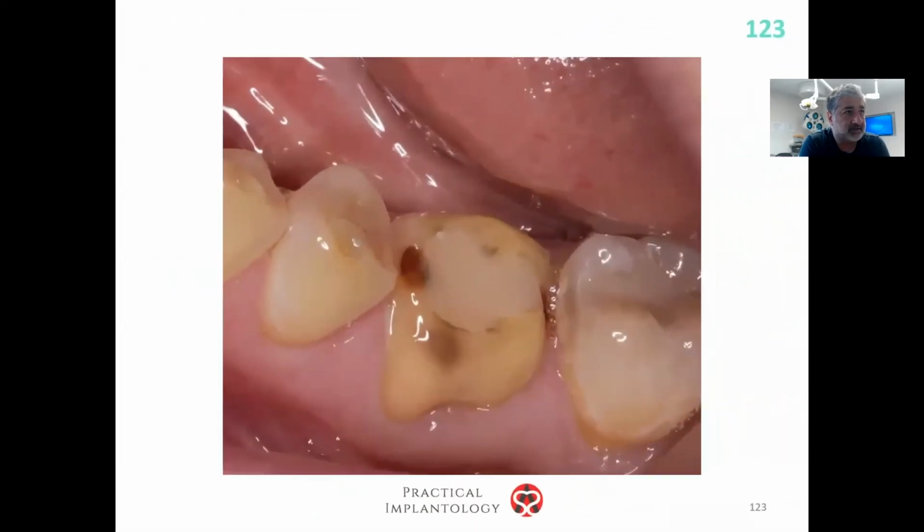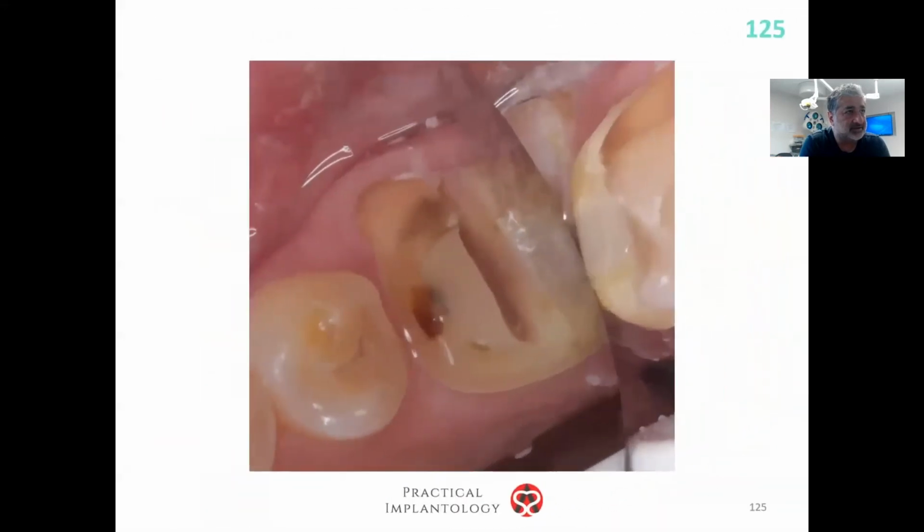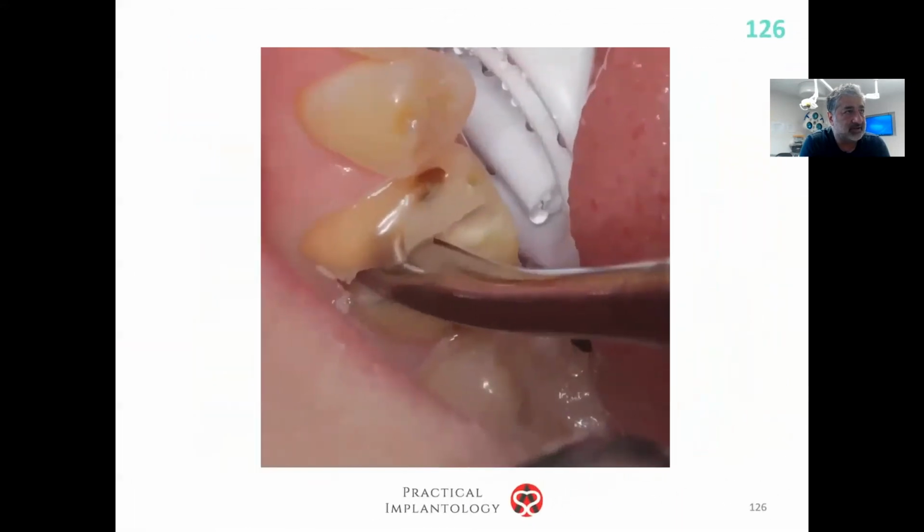Next case. So we've got a tooth, the crown that's come off. There was a fracture underneath this tooth. There was an area, so we decided to take this tooth out. So again, usual principles. You can say do this yourself. Now I've split. I've not gone through that.